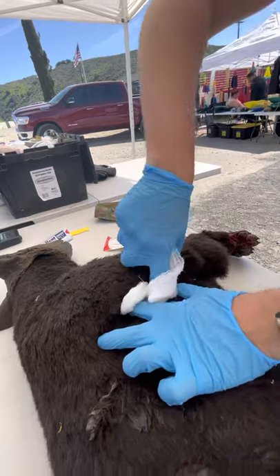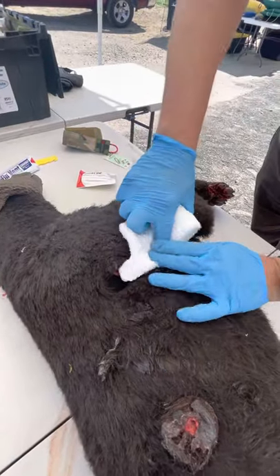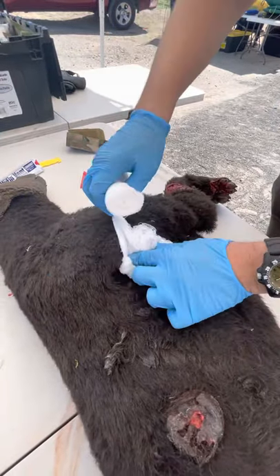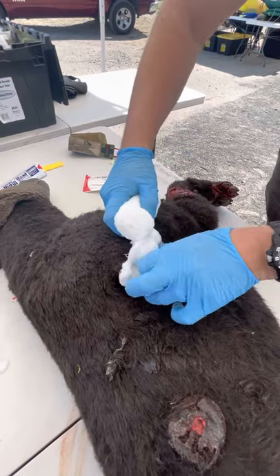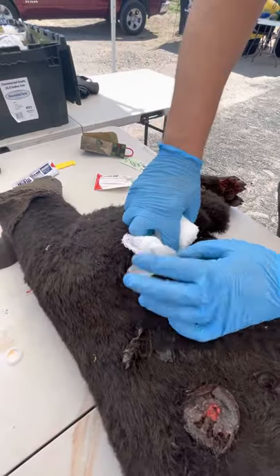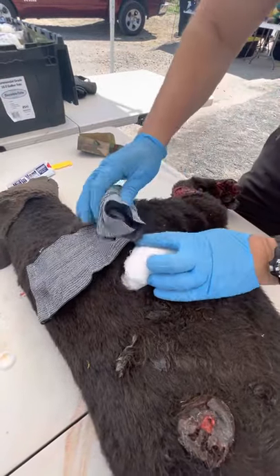You want to pack and create pressure in that cavity, filling all the corners as much as you can — going to the bottom, going to the top. It's not entirely similar to humans in terms of overall treatment. You want to think about securing the dog and keeping them calm — that's why we need to have a muzzle. This is all stuff that paramedics and law enforcement folks may not be used to since we don't deal with canines often. Pack this cavity as much and as deep as you can, and if you have any excess, leave it on top to help focus the pressure.